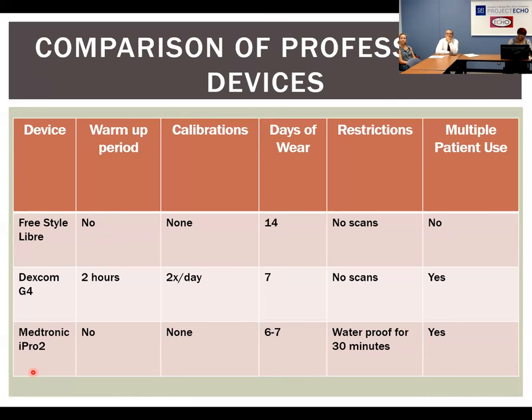Okay. So I will tell you, I put it on one of the residents, and when she went to take it off, she was a little miserable. She was like, this kind of hurts, and do you have anything? So sometimes you need some of that adhesive remover, because it adheres pretty good.